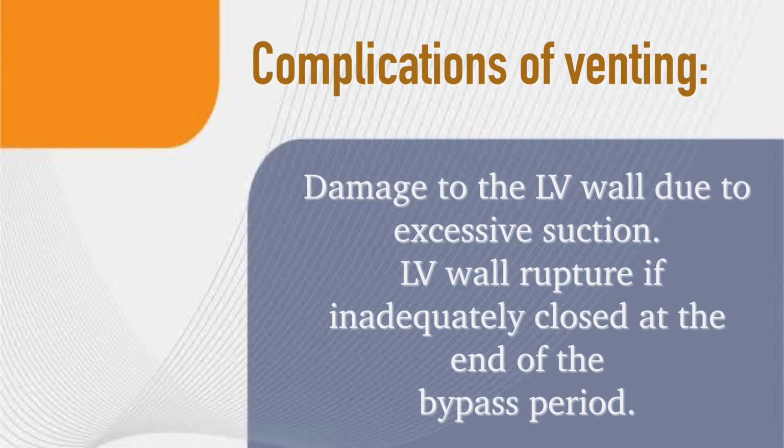Complications of venting: damage to the LV wall due to excessive suction, and LV wall rupture if inadequately closed at the end of the bypass period.